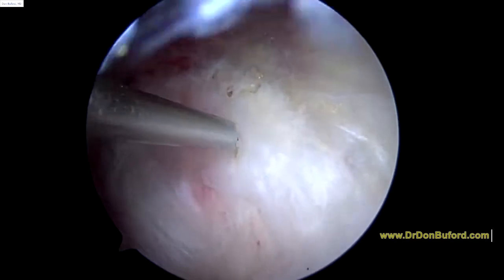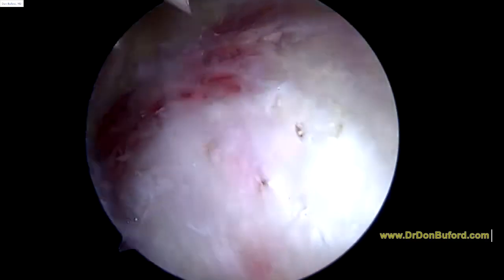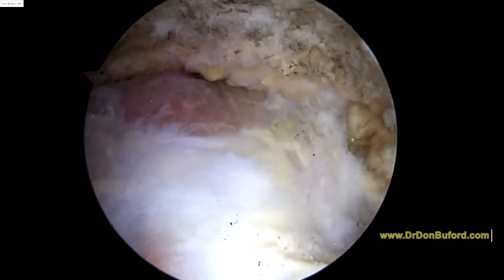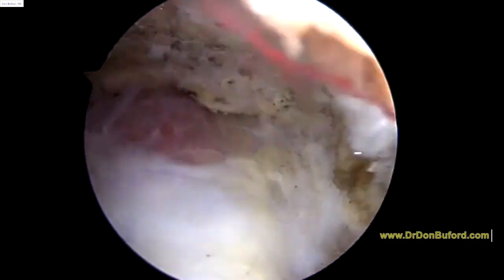The calcium deposit is small and I think we're not going to have to worry about that anymore now that we're taking care of everything else. We've done our decompression, and I'm going to finish up the decompression just to make sure that the acromion is flat. So we'll take our burr and show you that in just a minute.